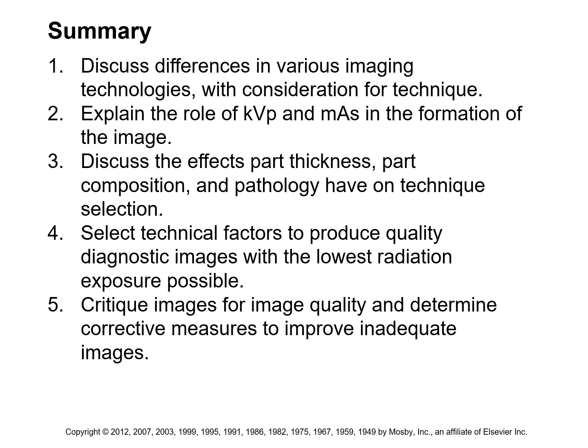What are your takeaways? I want you to understand kVp is penetration power, mAs is the number of photons. Okay. We used to talk about buckets of paint and throwing paint against a wall. So chucking paint against a wall, paint from a bucket. How much paint do you have in the bucket? Well, that's the mAs. How hard are you chucking it? That's the kVp. Or the shotgun shell analogy, that works too.